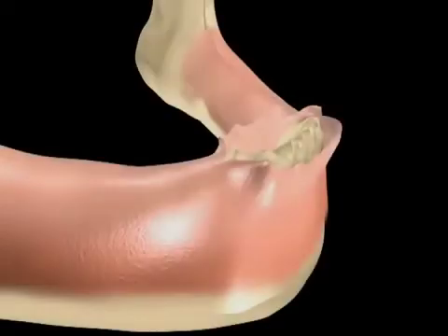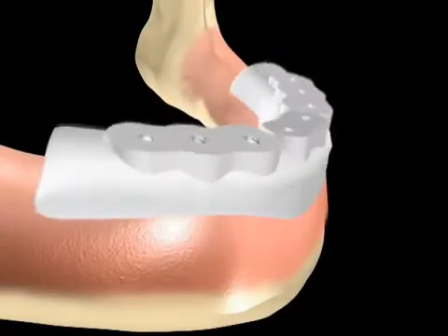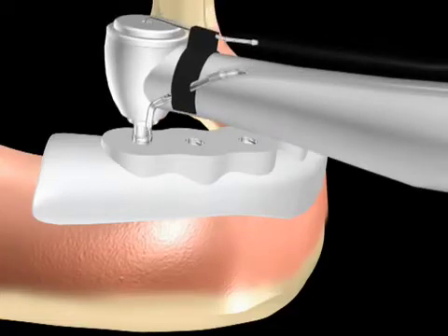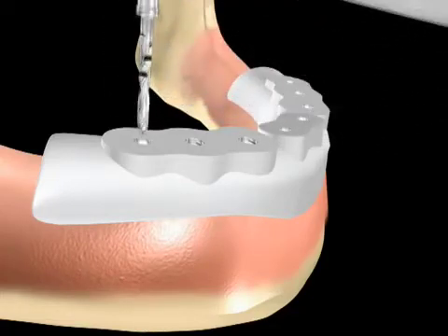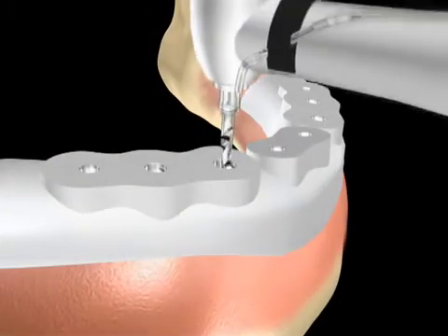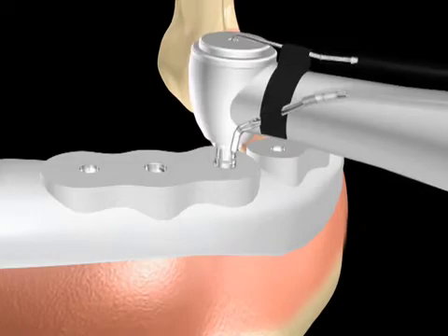After the teeth have been extracted, the customized surgical stent is placed and a 1.5 mm pilot drill is used for the initial penetration. Upon completion of the pilot drill, the osteotomy site is enlarged with the use of a 2.5 mm drill.